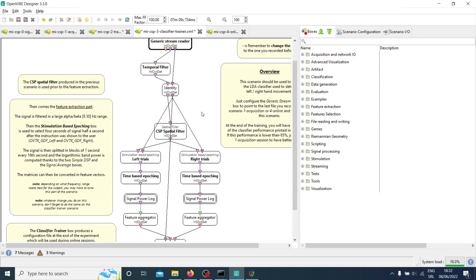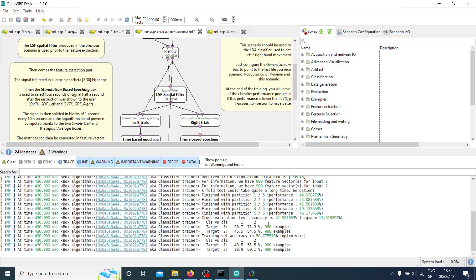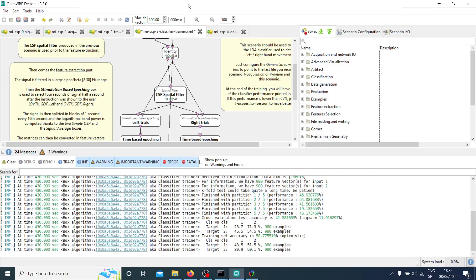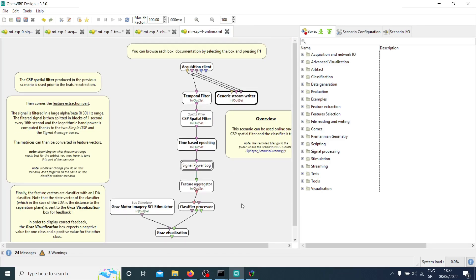The classifier trained with no errors. It gives an approximate cross-validation classification accuracy — the first class and the second class — showing how successfully it classified left from right hand motor imagery. But remember, here we have just fake signals, so the classification result doesn't really mean anything. With real EEG data from a participant, this accuracy would reflect actual classifier performance.